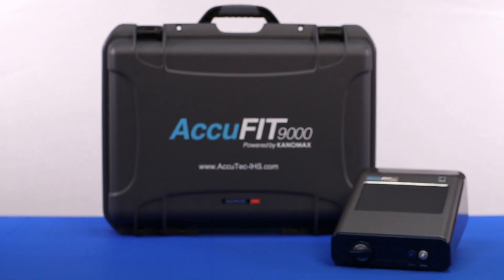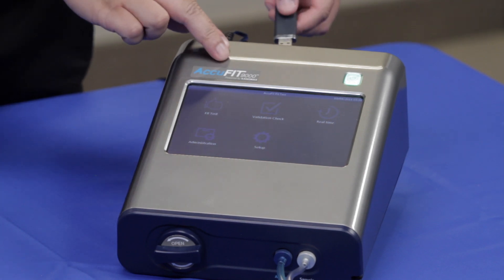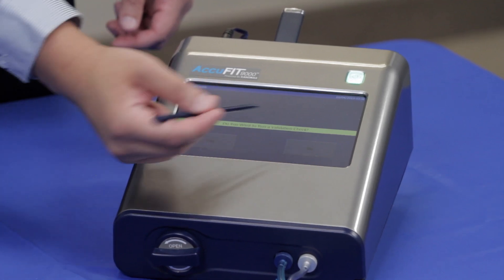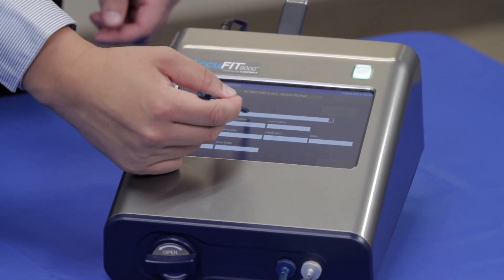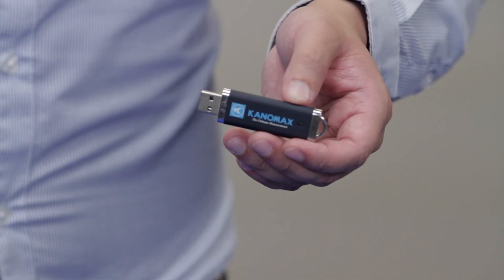There are two primary modes of operation for the AccuFit: standalone and PC mode. Standalone mode offers the flexibility to use the fit tester away from a PC via the touch screen display to navigate through the fit test exercises and store records on the included USB memory device.